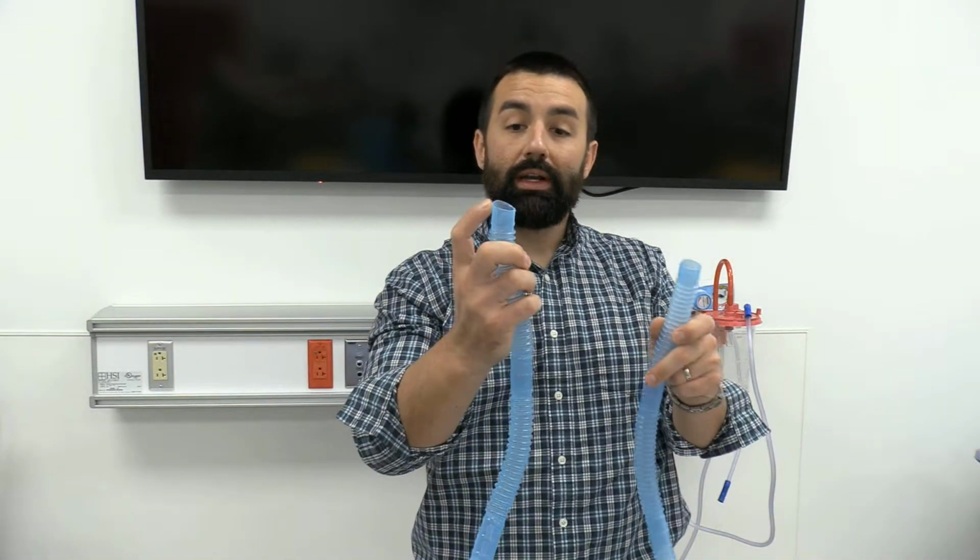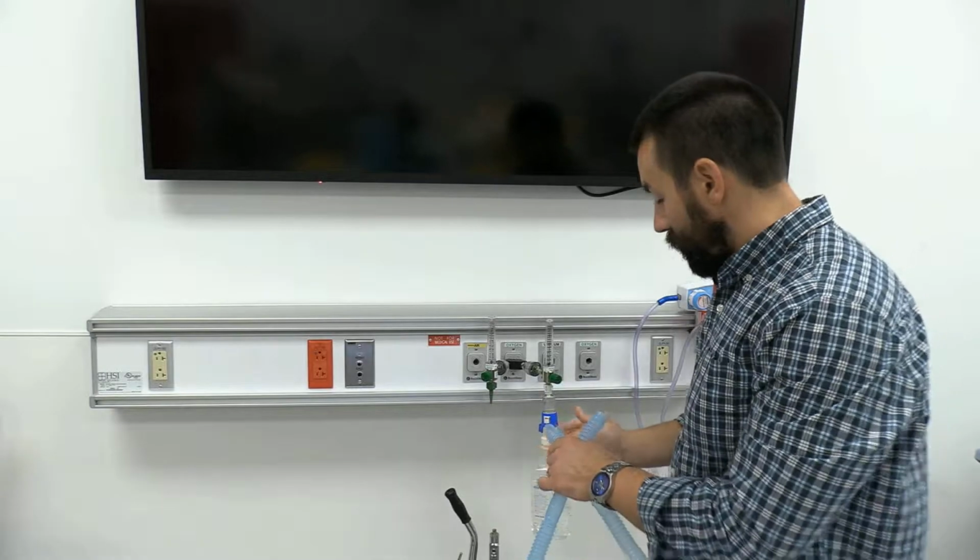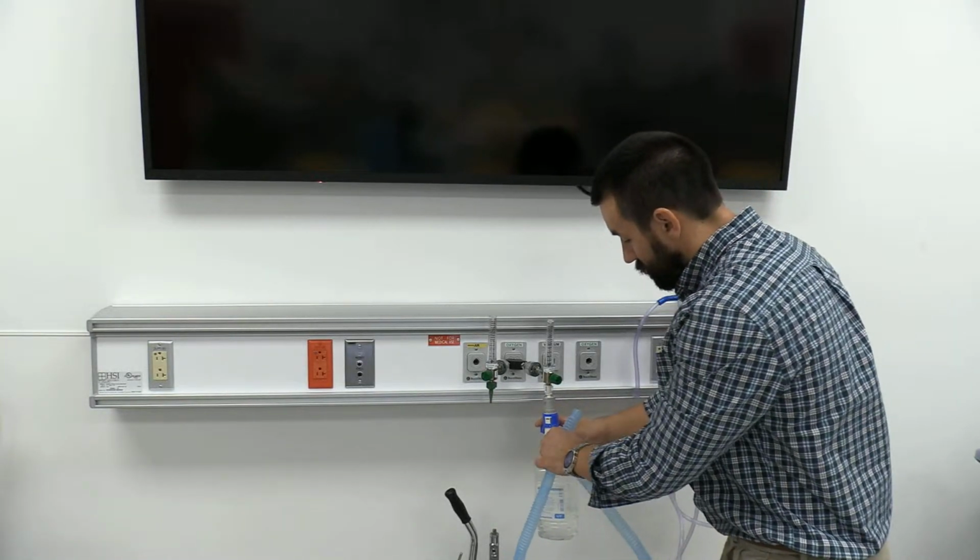If you cut it pretty nice on this line, you can see whoever cut this one didn't do a great job, a little crooked there. It's going to go on just so much more simple. So we're going to go ahead and put this piece on.